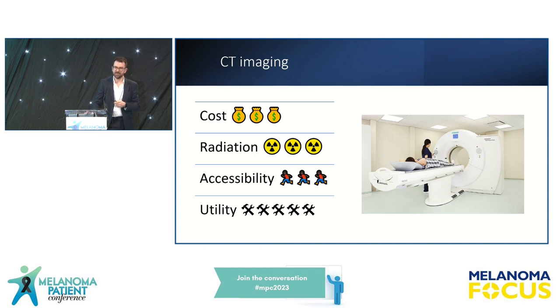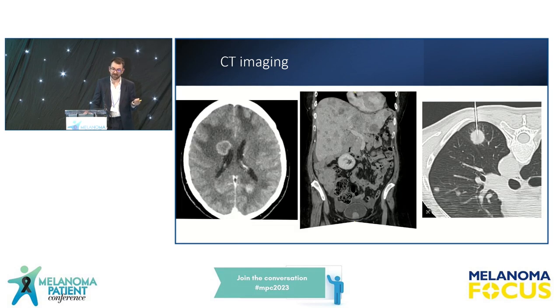CT scanning is obviously the kind of workhorse of oncology imaging. We use it in the staging for a lot of cancers, including melanoma, and also for the follow-up as well.